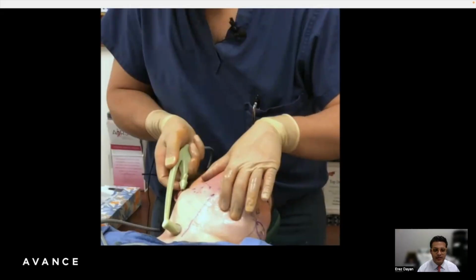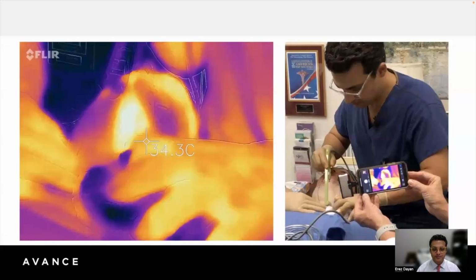The second variable is the fibroseptal networks, which are holding the skin to the underlying fascia. That's really our target. We want to heat those fibroseptal networks and allow them to contract almost like a parachute over the coming 6 to 8 weeks. So those fibroseptal networks are most extended when the tissue is tumesced versus doing it after the liposuction. So we prefer to do this before liposuction when it's performed in conjunction.